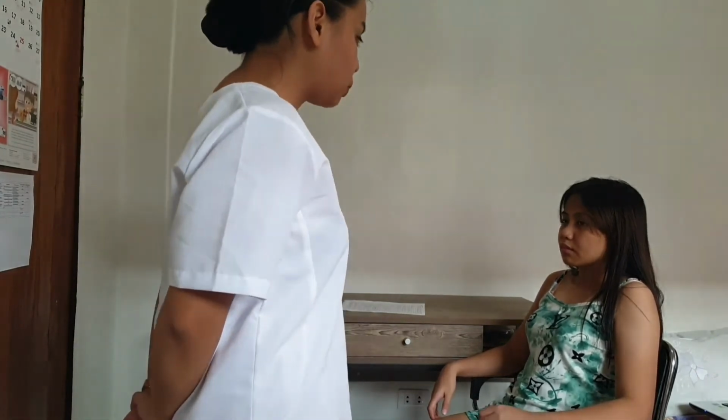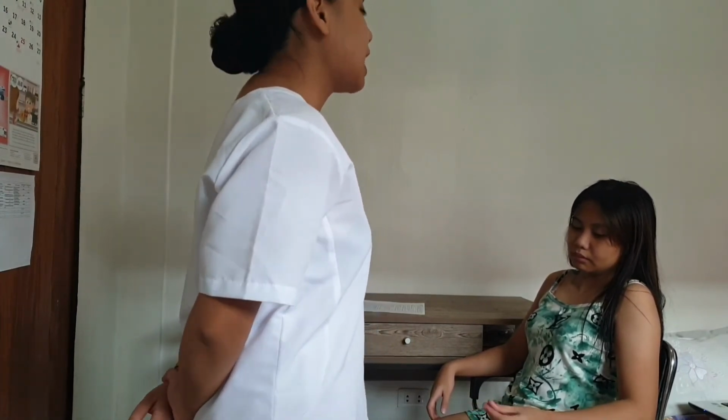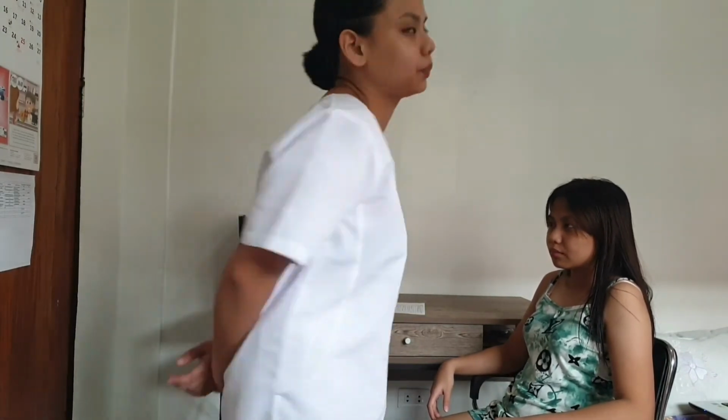Before anything else, I would like to confirm your identity. Your name is Rihanna Domingo, you're 20 years old, your birthday is February 22, 2001, and your civil status is single. Are those correct, ma'am? Yes. Okay. Thank you so much, ma'am. I'll be right back. I will just wash my hands.